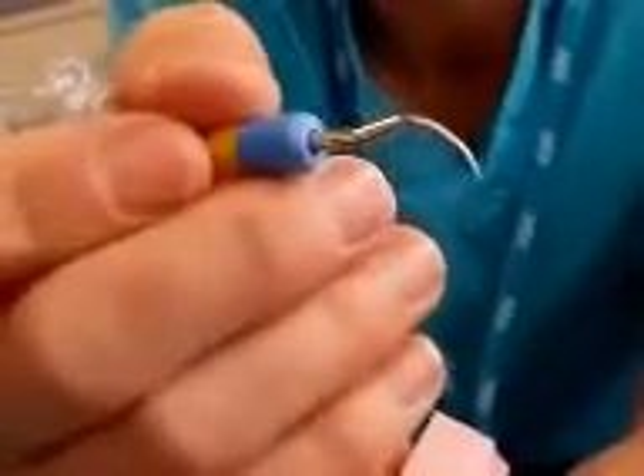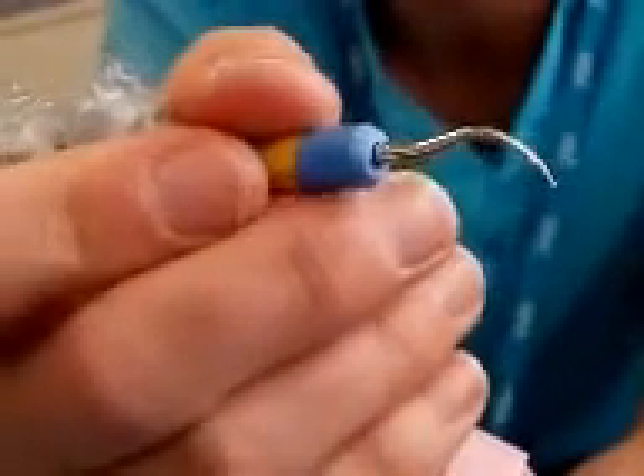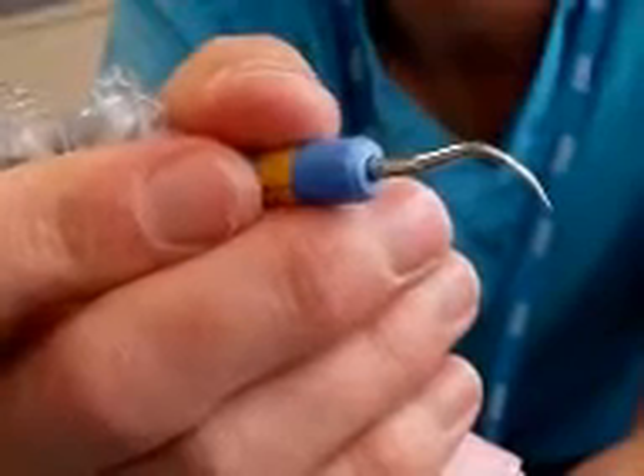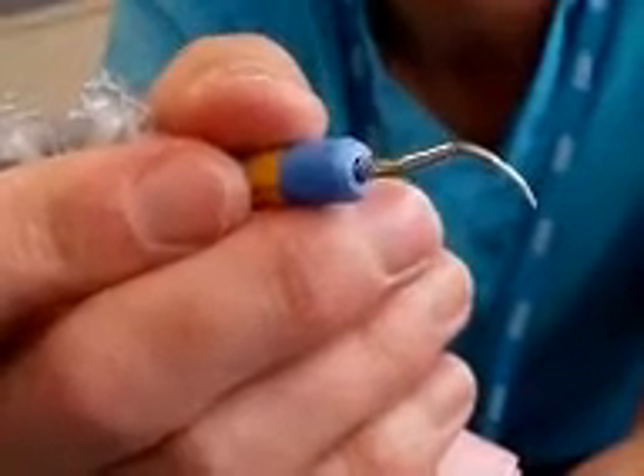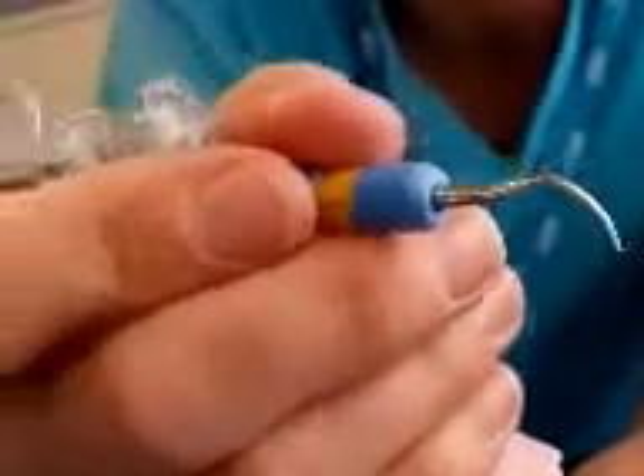The next thing to remember is that the gingivae are extremely fragile things, and we want to keep them there. We don't want to be ripping them up and removing gingivae. Apart from anything, it's painful, and it's unnecessary — it can probably cause recession and all sorts of problems.